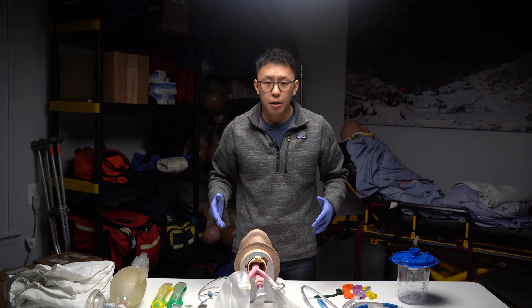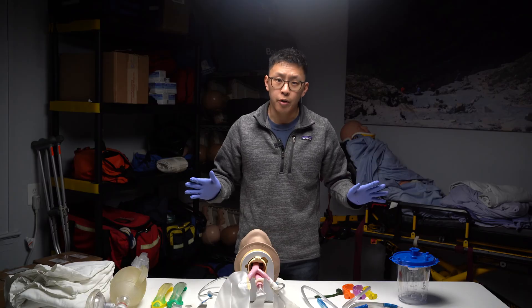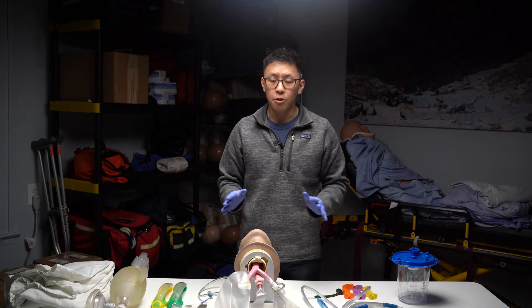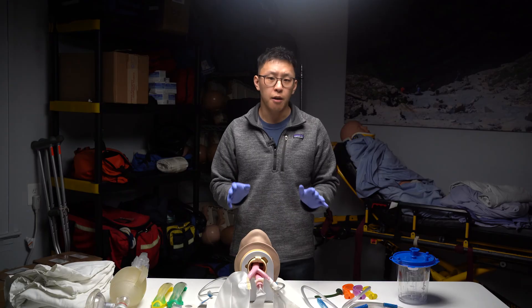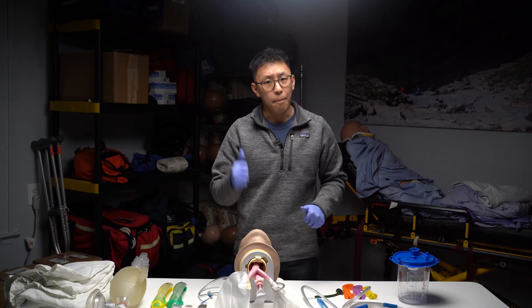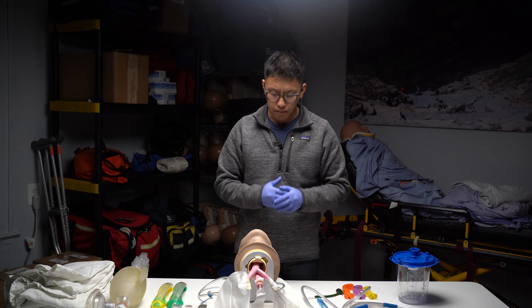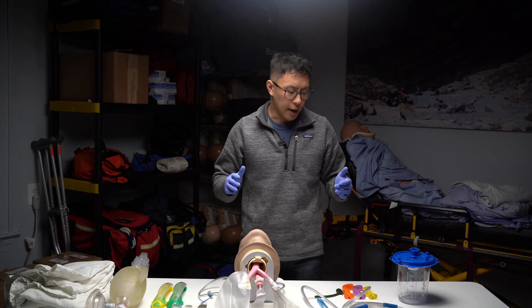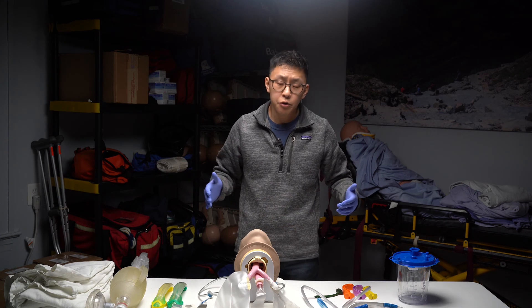We need your patient to be unresponsive with a pulse but not breathing, and they can't have a gag reflex because we want to see if you know how to place a supraglottic device. You're going to be dispatched to whatever location for a patient who's unresponsive. When you arrive, ensure the scene is safe and that you have your BSI — gloves, a mask, eye protection — and then approach the patient.